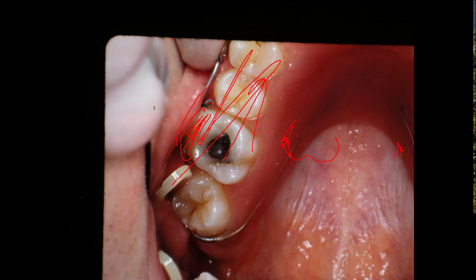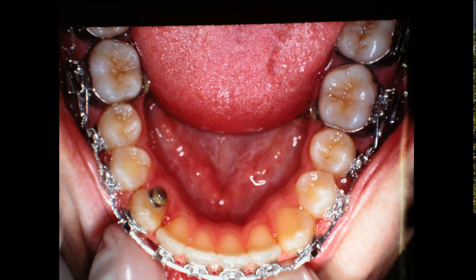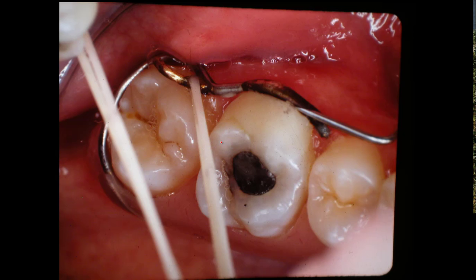And so it'll work out the problem between the pressure of the tongue. And if you don't do this, on many of those cases, if you hadn't really brought the maxilla out that far, then it will relapse. It'll push the doggone lower jaw on out there. But if you do this, you can hold these cases in after surgery, and the surgeons will love you for being able to do that. All right, we'll show you.